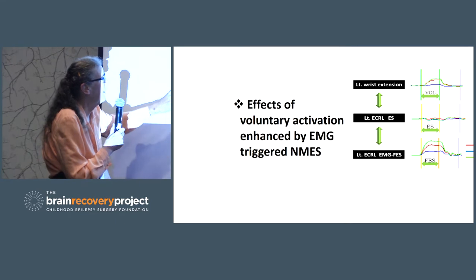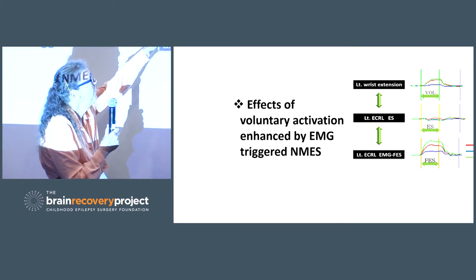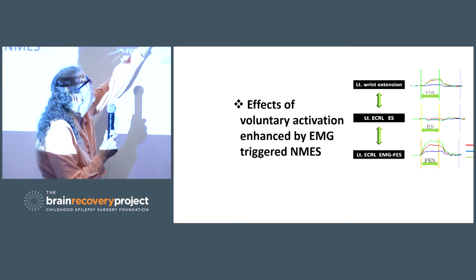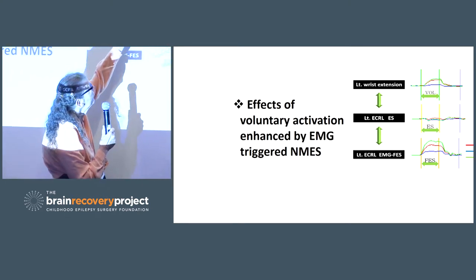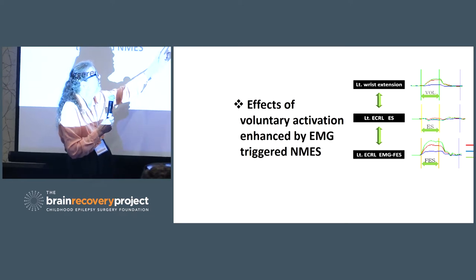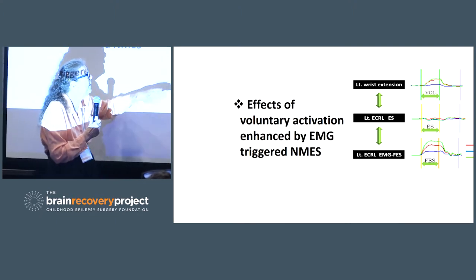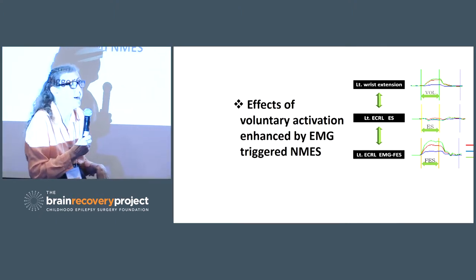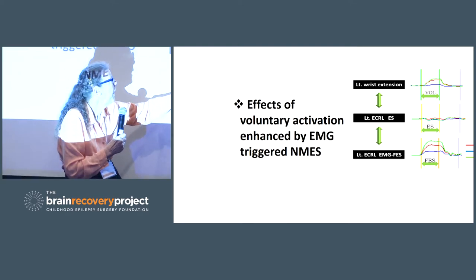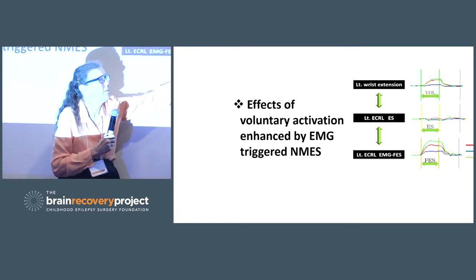So this diagram actually is not an fMRI one, but what it's showing is, with voluntary contraction, how much activity is there in the brain. And the green line is the one that we really want to look at here. So the green line under a voluntary wrist extension contraction is not very good, okay? And it's even worse when it's used by stimulation alone. So if the patient's not trying to respond, then there's really nothing going on in the brain. When we combine electrical stimulation with the voluntary, we see that we get a much, much higher level of activation.